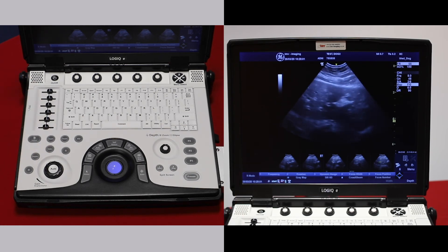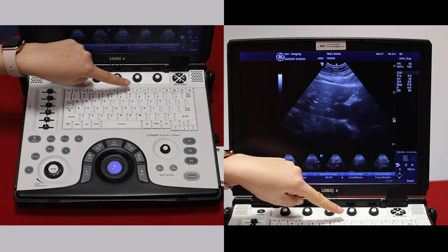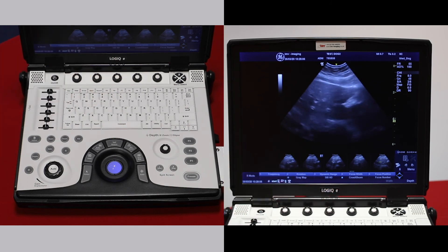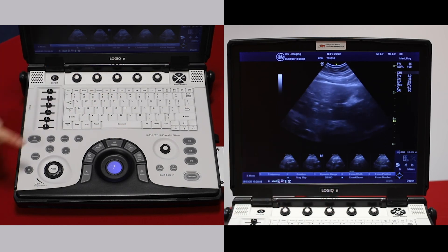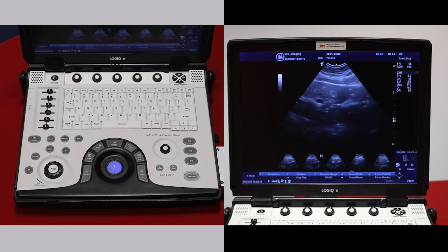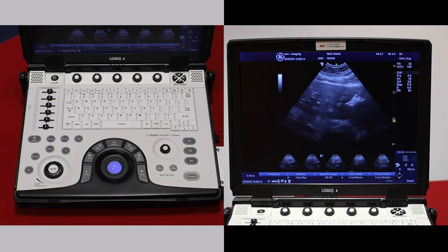If you have ECG, it is enabled with the function keys, F8. And if you have continuous wave Doppler, that's activated by F9. That will only work if you have a phased array probe connected.